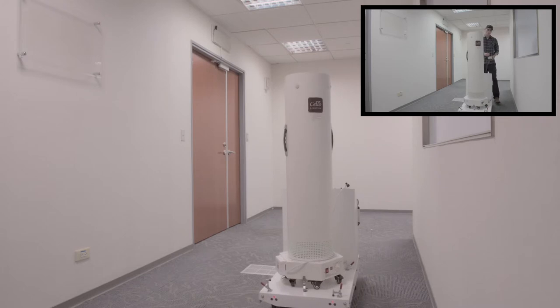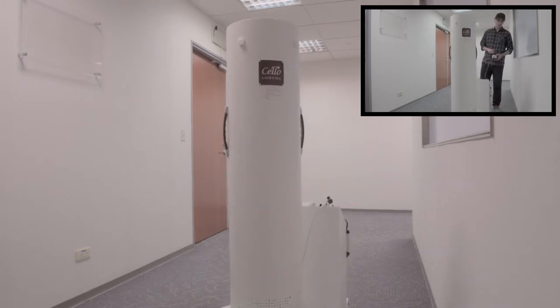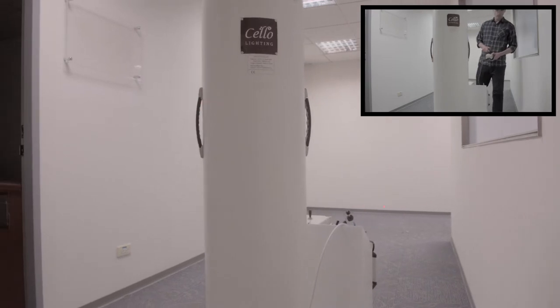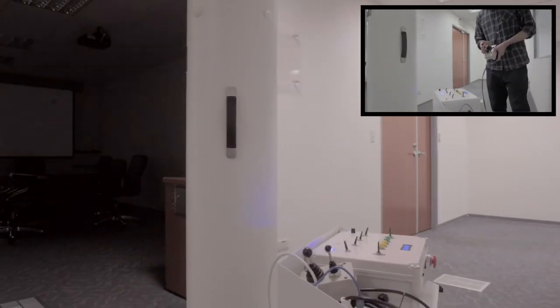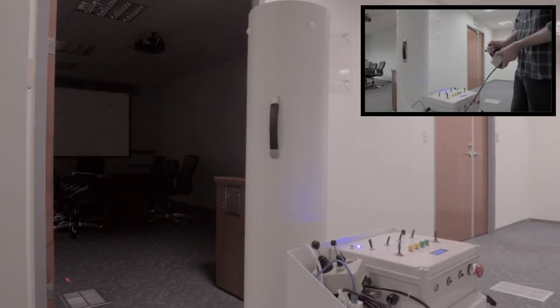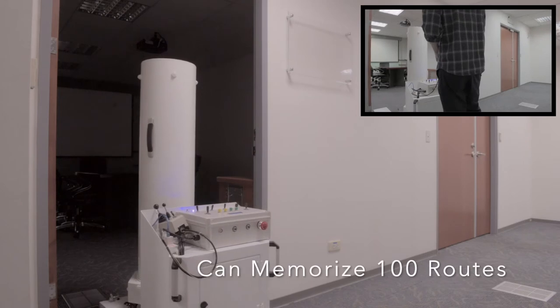Once trained by users, the Cello UVC Robot can automatically navigate the same route every day. In total, the Cello UVC Robot can memorize up to 100 routes.